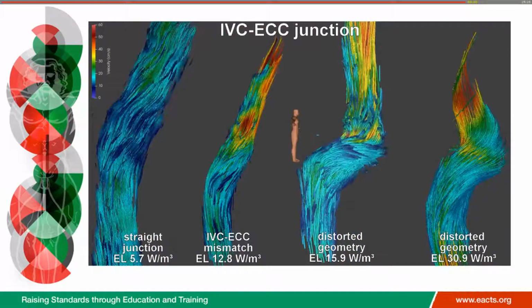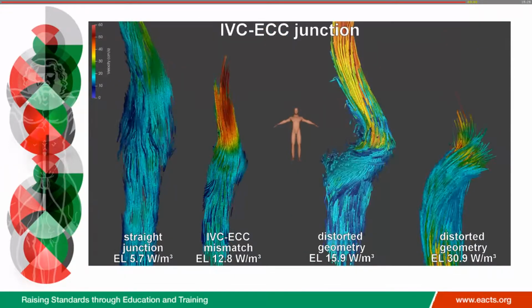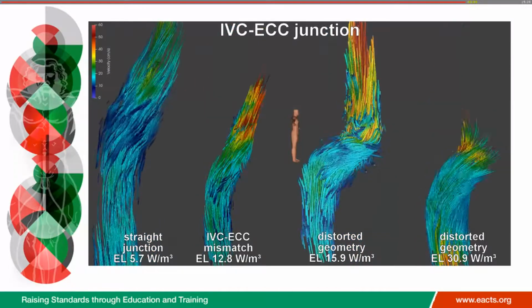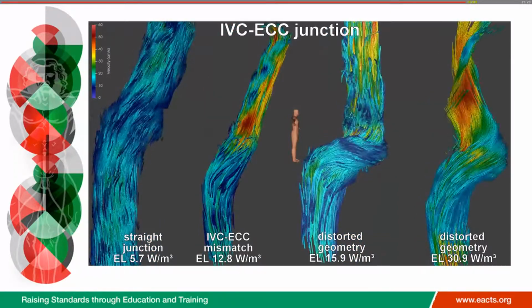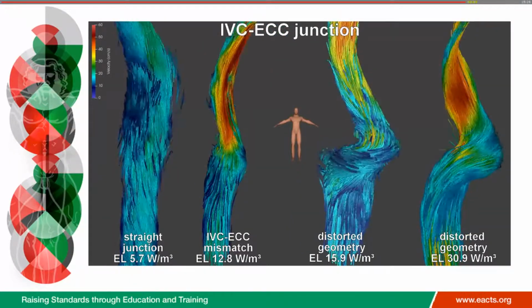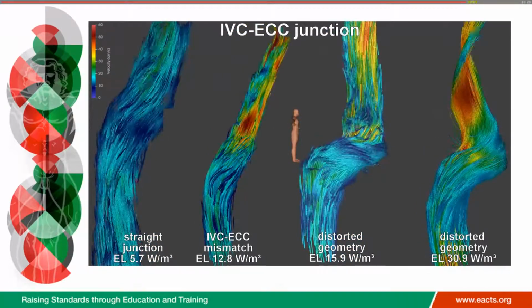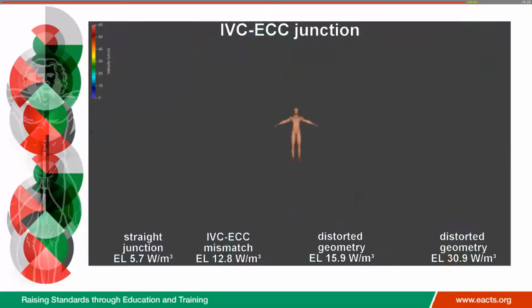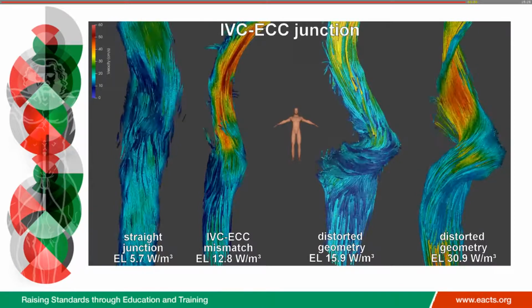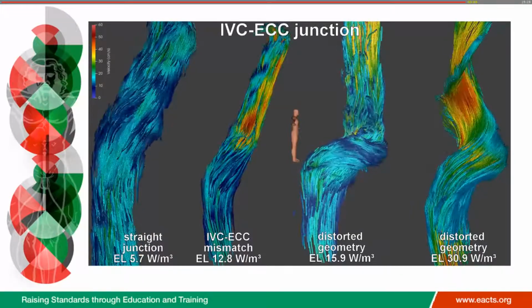Yes. So you see it also from this side, because you now look at the right lateral view. It's not changed, but there is indeed a difference. It flows parallel to the vertebral column, and then it goes a bit anteriorly to where it normally connects to the right atrium. So this is actually the normal way you would suspect it. And maybe there is some slight difference between patients about the anterior movement of this. But essentially, for these connections, where they are extremely distorted, I'm not sure if you can preoperatively identify those patients already. But we essentially don't know.